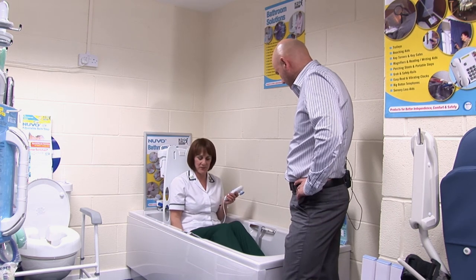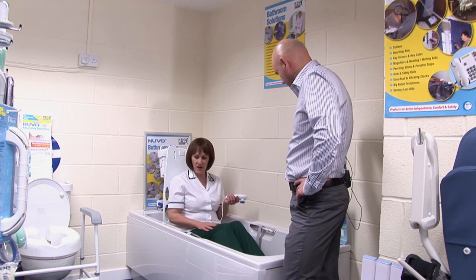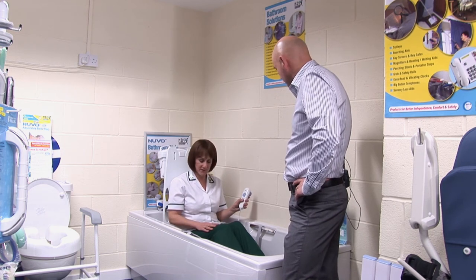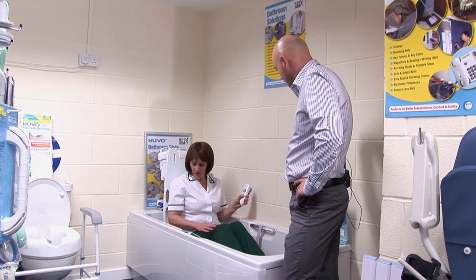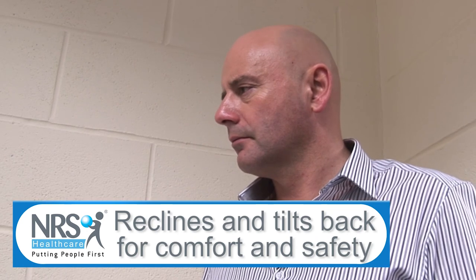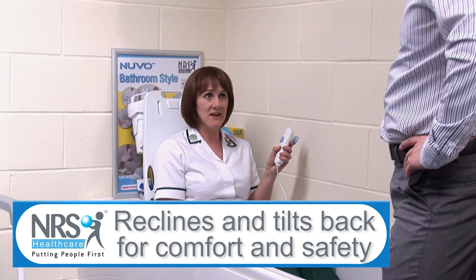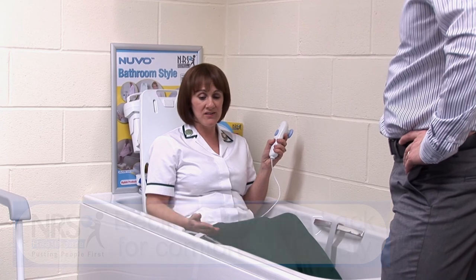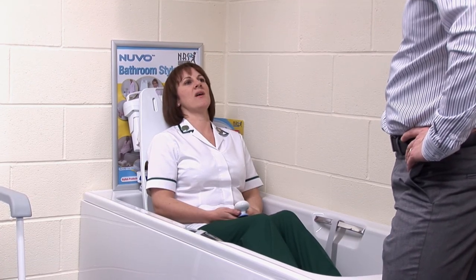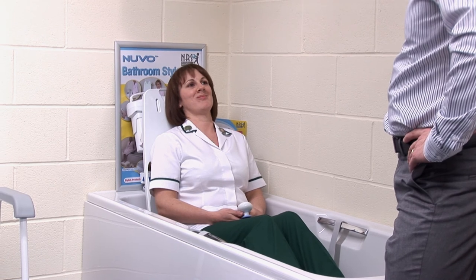So you can have a nice bath in that position. Or if you want to be more comfortable and recline back a bit and have a relax, you can keep your finger on the button. This bath lift has got a unique feature in that the base tilts — so if you're likely to slip forward off the seat when it's wet, this tilts to prevent you slipping forward and reclines you back so you can have a nice relax and have a wash. And relax is definitely the word. I'm sure you'll agree that's a piece of kit that would make bath time a whole lot easier.